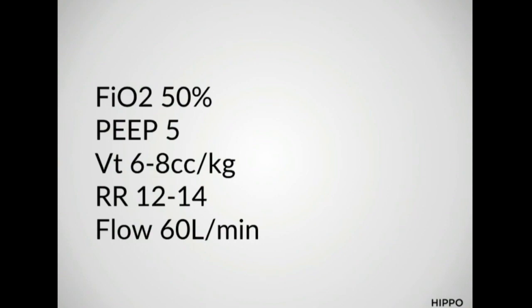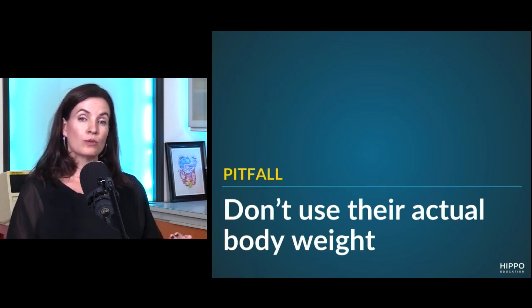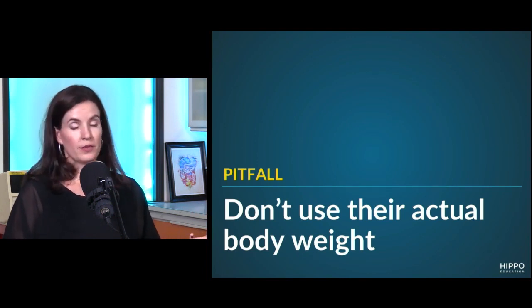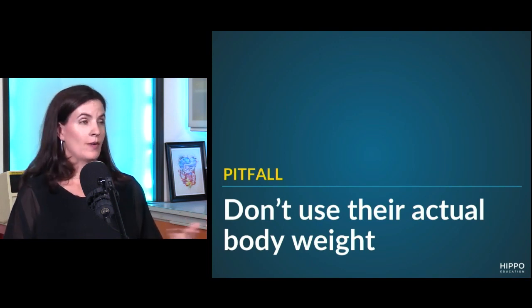So there are a few pitfalls here that we want to avoid. Number one, when you're setting their tidal volume, we don't use people's actual body weight, which is a good thing because now you don't have to ask people what they weigh, because they weren't going to tell you the honest answer anyway. But guys, what do we use instead of their actual body weight? I'm going to assume the ideal body weight. The ideal body weight, right?